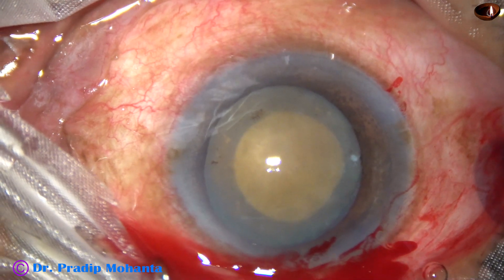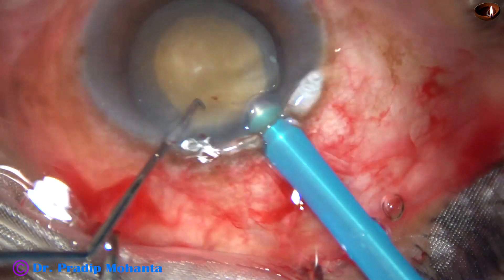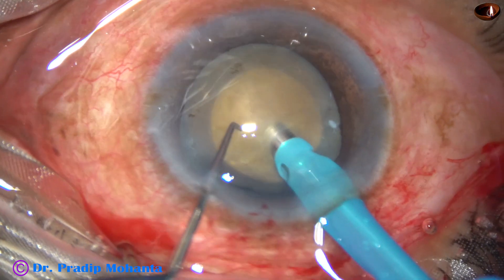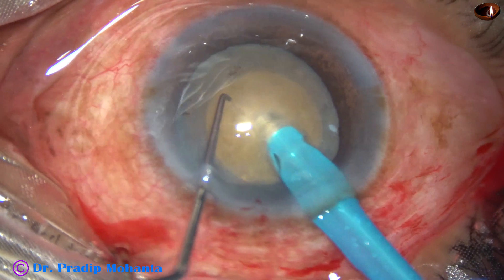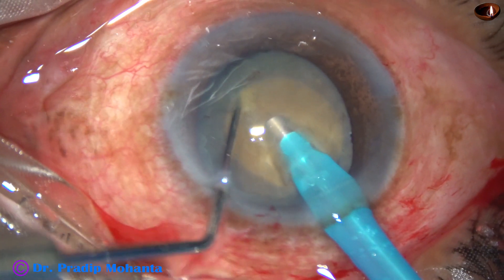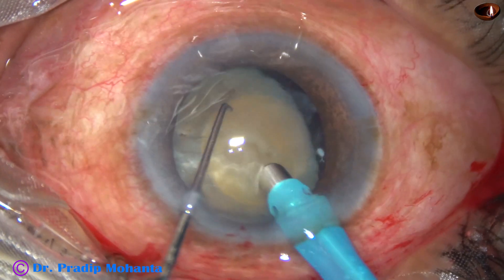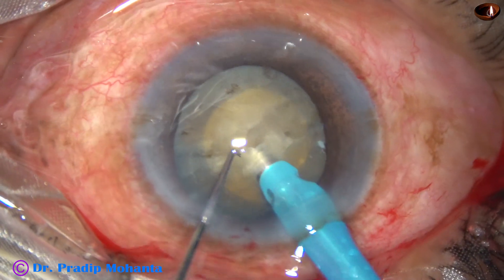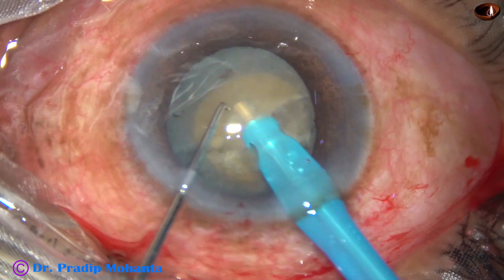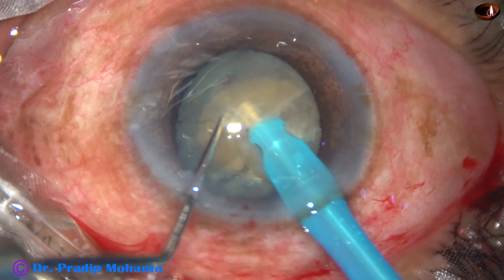This is an Oertly Caterex III phacoemulsification unit. See how to hold a free-floating nucleus without an epinucleus. Go bevel down, occlude the tip, go into the substance of the nucleus, move for a distance, hold the nucleus very firmly, reach near the opposite equator, and then try to crack it. This is a very good crack. In a free-floating nucleus, always go bevel down, go into the substance of the hard nucleus, move for some distance, reach near the opposite equator, hold the nucleus very firmly, and then crack it. This is another good crack.